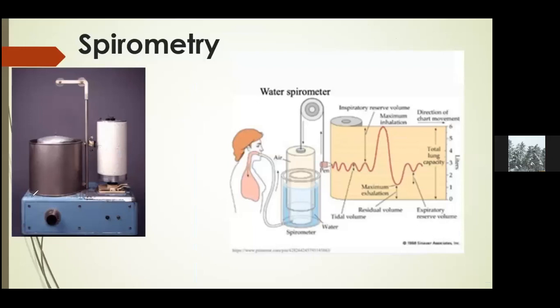Now, to make it easier, I'll bring you to this. This is the same setup. So we have our spirometer here. This is the bell that is turned upside down, and it has a string that is attached to a pulley, and the pulley is attached to a pen, and the pen is writing on this calibrated paper, which is tied around a rotating drum. As you keep on breathing, you can see the mouthpiece has an inlet into the middle container.